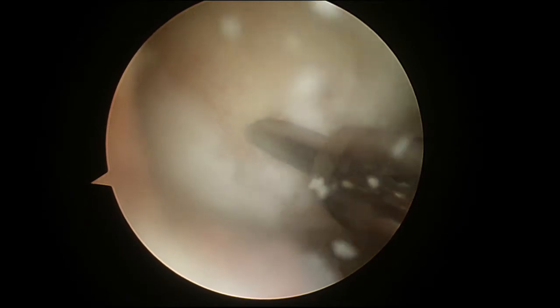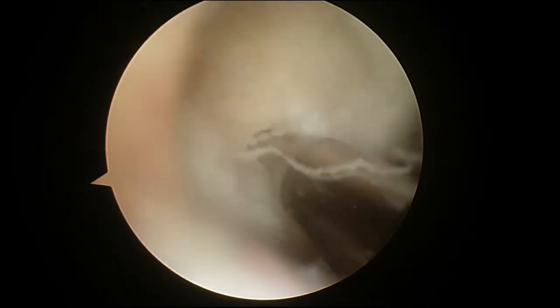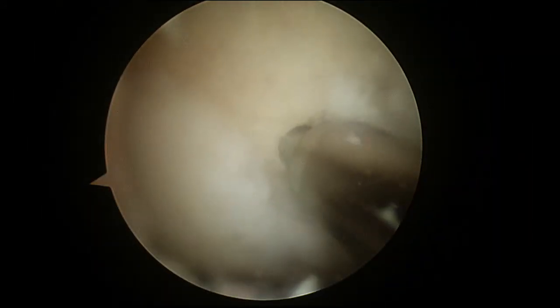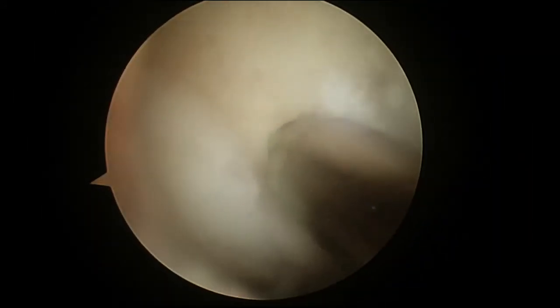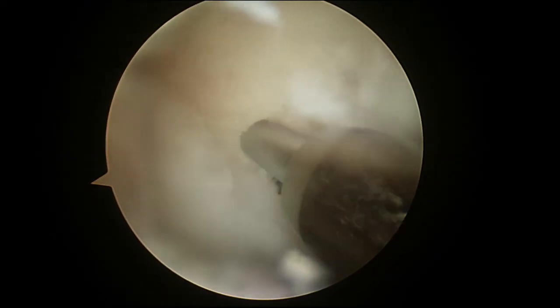I am using a PowerPick from Arthrex to perform a microfracture. The goal of the microfracture is to poke holes in the bone and stimulate a super clot. I have put one hole in and I am then going to space apart the remaining holes.